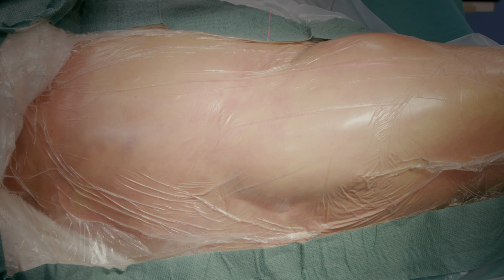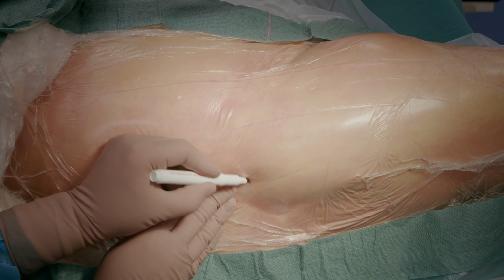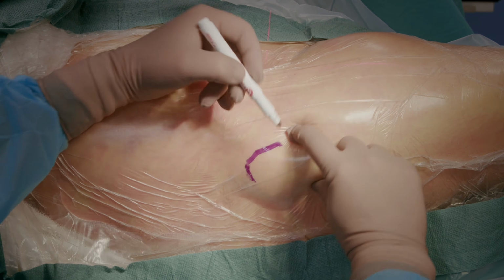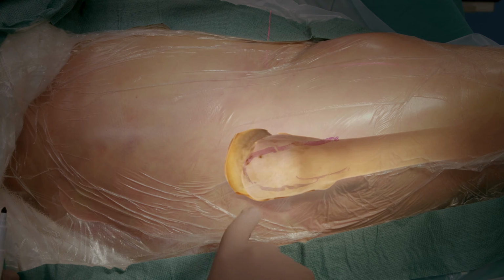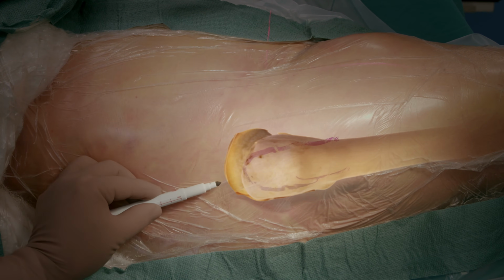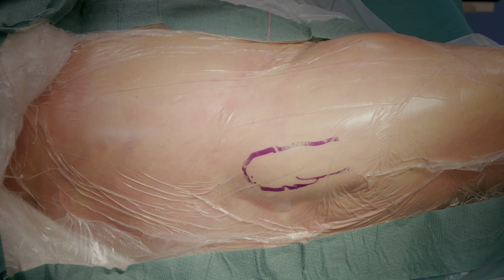Next, let's define the site of the incision. Palpate the tip of the greater trochanter and outline the direction of the femoral shaft. It is important that the incision is not made exactly here at the level of the tip of the greater trochanter, but cranially from it, since the nail will be inserted obliquely from above.